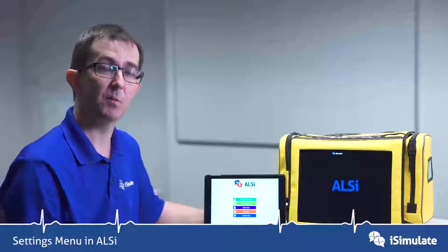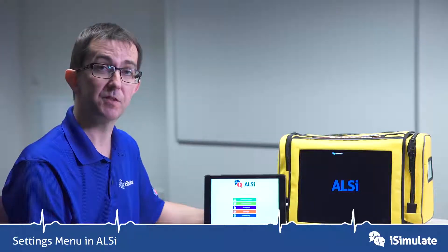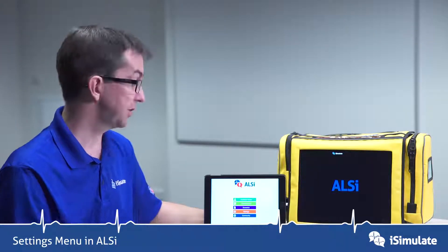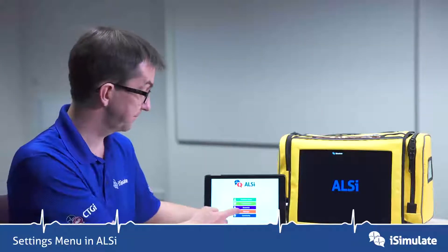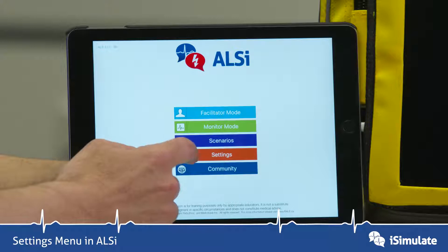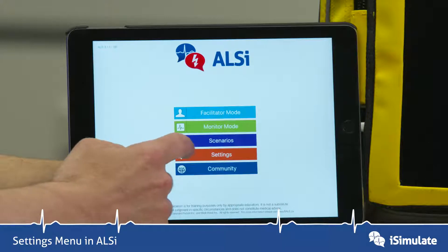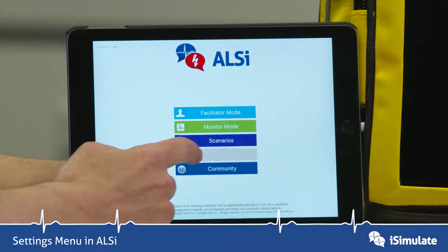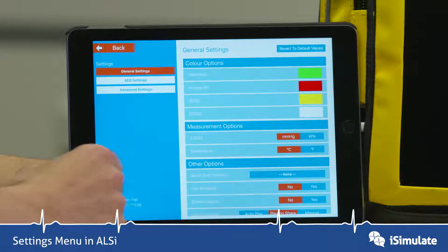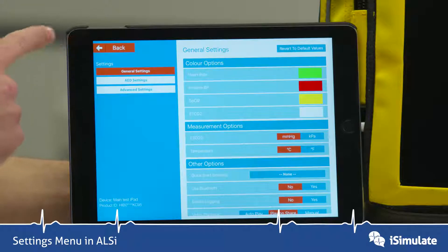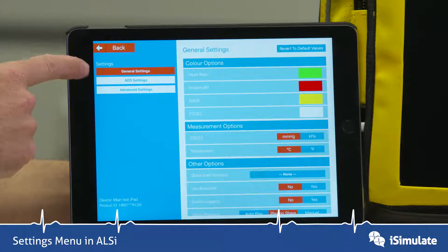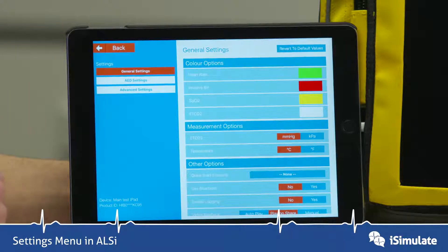Let's have a look at what we can change in the settings menu, which is on the main screen. We just tap on this orange button here called Settings. There are a number of things you can change here: General Settings, AED, and Advanced Settings.